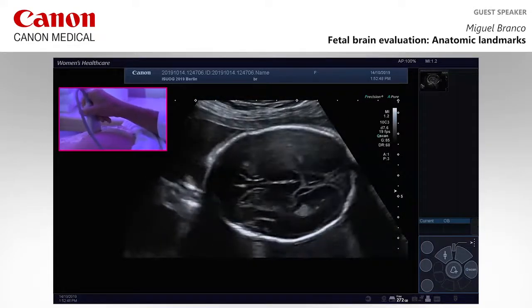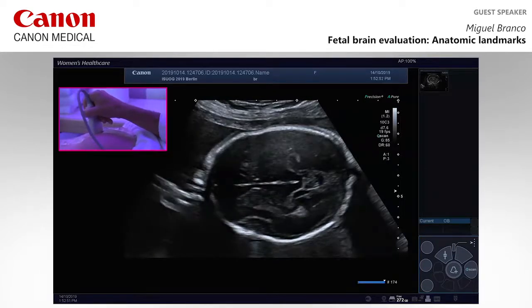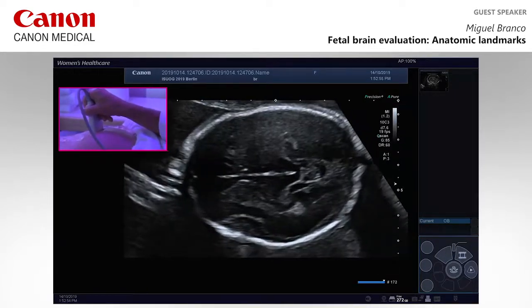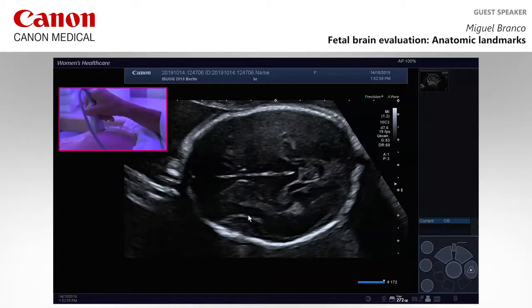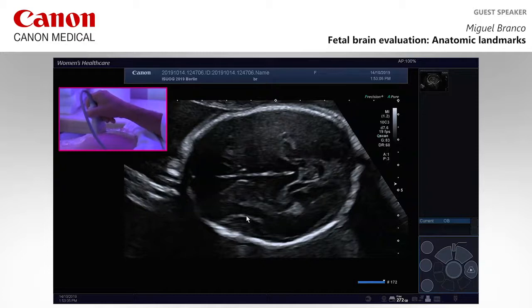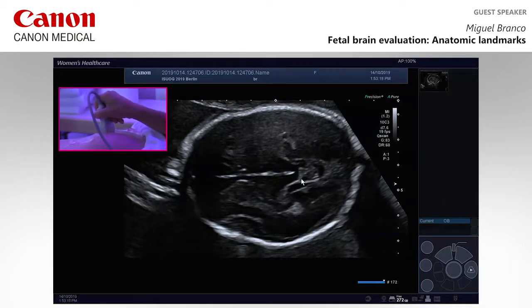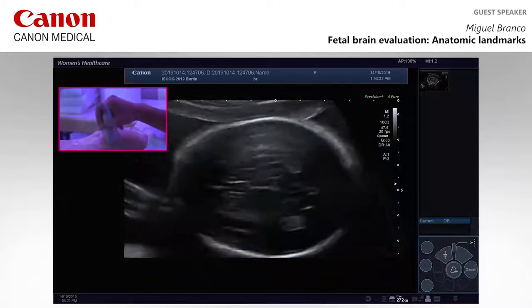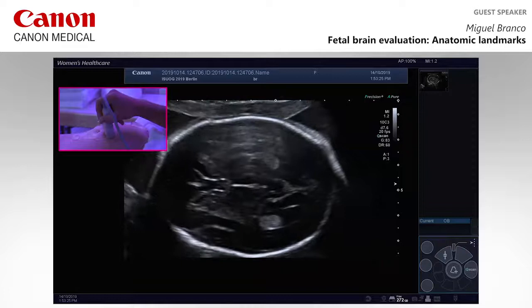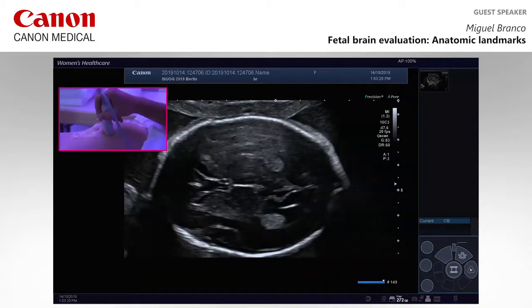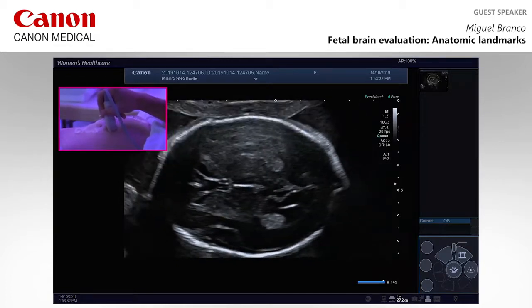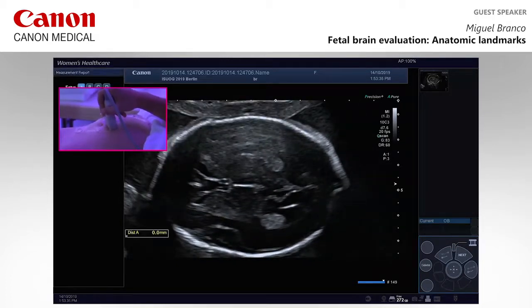We should also take a look at the sylvian fissure. This lady has 23 weeks. This angle, as described by Edwin Quarello at 24 weeks, should be 90 degrees — it's almost there. The landmark for this evaluation is the fornix anteriorly and the ambient cistern posteriorly. For measurement of the lateral ventricles, we use as a marker the parieto-occipital fissure.